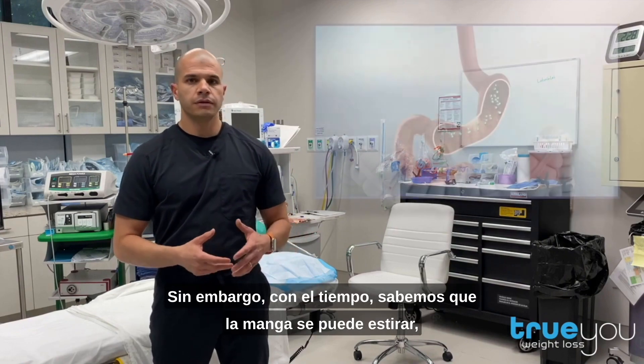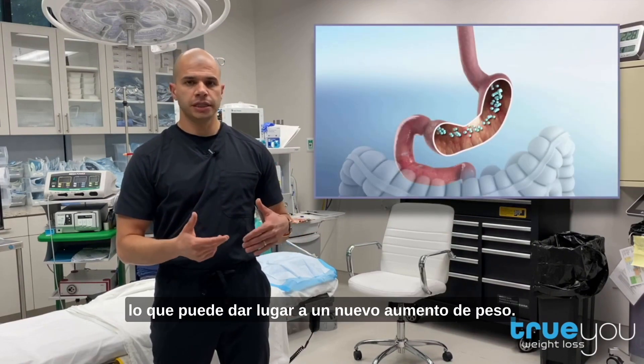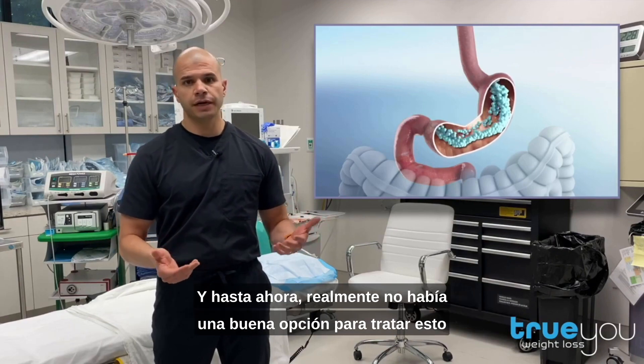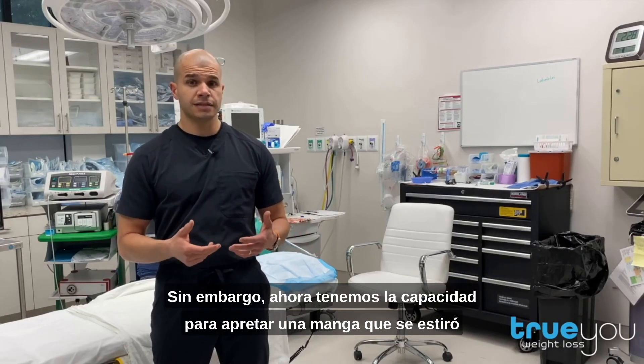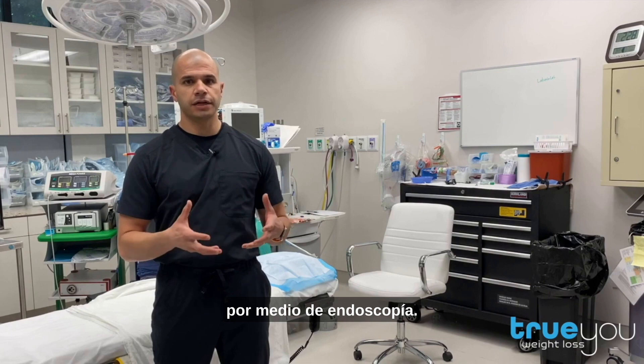However, over time, we know that the sleeve can stretch out, which can lead to weight regain. And until now, there really wasn't a great option to address this other than major surgery, which carries significant risk. However, we now have the ability to endoscopically tighten a stretched-out sleeve.